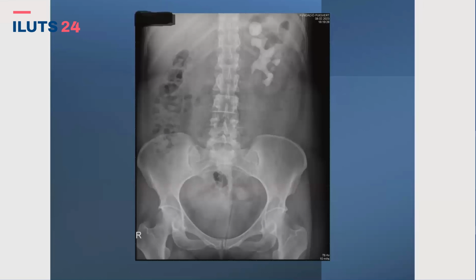Given the fact that it's perfectly functioning, and given the fact that maybe the pelvis is not completely inside the kidney, I will go for a lap or robotic approach to remove. In case like that, pyelolithotomy? Yeah. And to do, it's what we do combined. Sometimes we have this kind of case. We start in doing the pyelotomy and we do a combined, but starting from the abdomen with the ureteroscope.